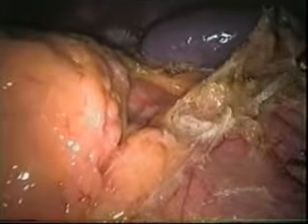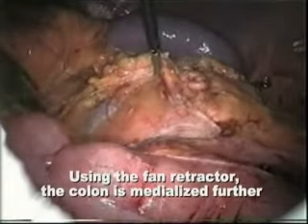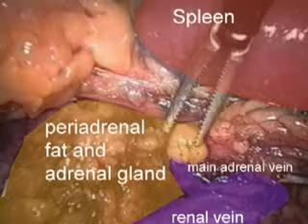The fan retractor is inserted through the subxiphoid trocar to further aid in medialization of the left colonic flexure. We now access the renal and adrenal vein. This sketch outlines the main anatomic structures. The renal vein, in which the main adrenal vein enters, is located in the lower right part of this image. The periadrenal fat, in which the adrenal gland is hidden, can be seen left and cranially to that. The spleen is in the upper right part of the image.